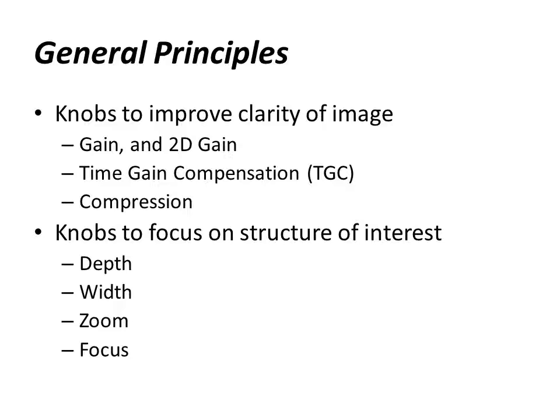These are the main knobs that we are going to be talking about. These are the field of vision of the ultrasound arc or sector, if you like. The two important considerations there are the depth that you're going to be scanning and how wide you are going to be scanning. The other thing is the use of a zoom. Again, this is best explained at the bedside, but that's another thing that you can use to focus on the structure of interest. And the other is something called focus itself, which is how you improve the clarity of a particular structure that you're seeing. We're going to go through some of these relatively quickly, one by one.